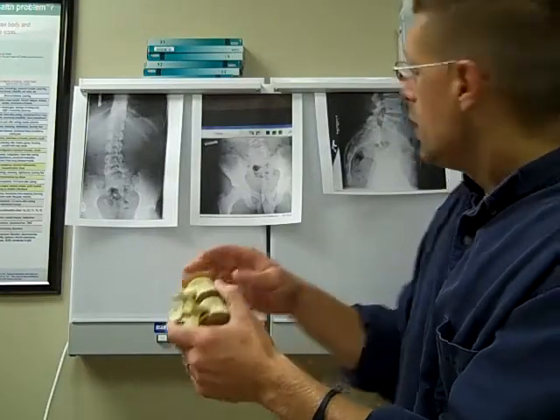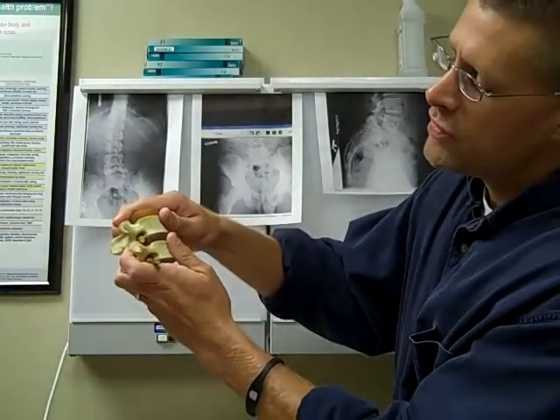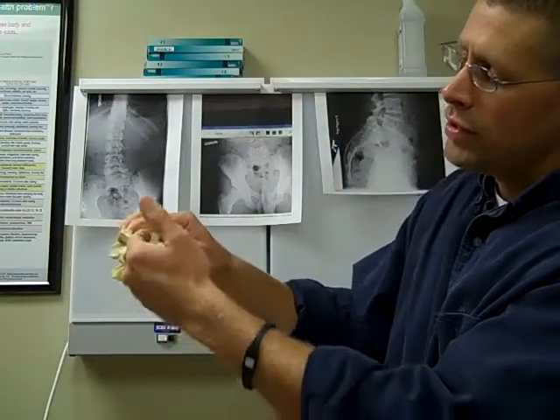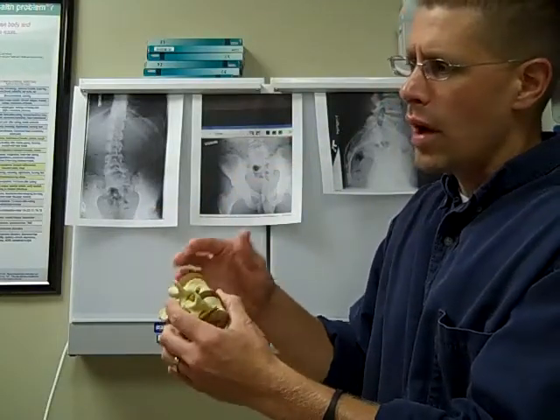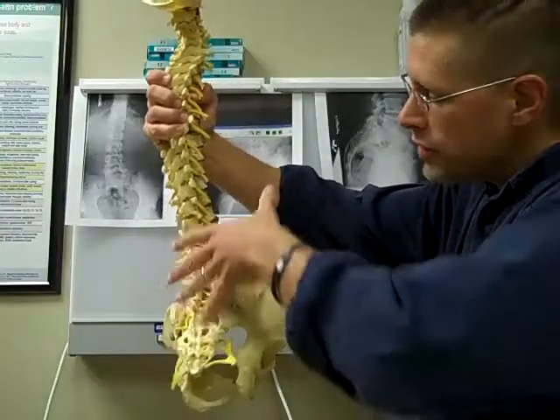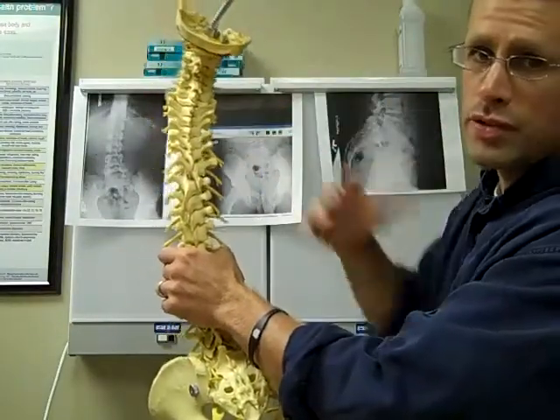Looking at the side view here, his spine has shifted forward. They call it a grade 1. It can go grade 1, 2, 3, 4, and grade 1s are the smallest of all of them. So it's not something that I would really worry about right now. But the thing that I would be concerned with is the fact that Seth's pelvis is really tilted down, causing everything to shift, and that's also going to cause everything above it to adapt.